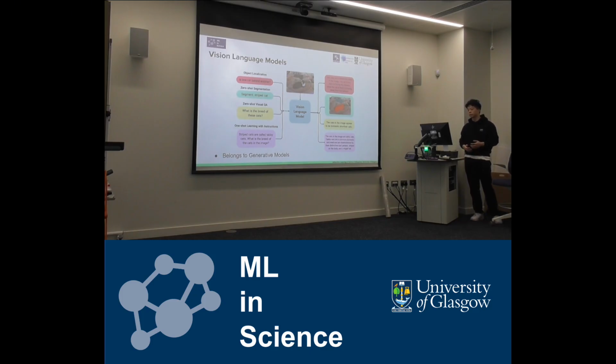In the past, these kinds of tasks often required retrieval-based methods, classification neural networks, or rule-based solutions, building a whole system. But now you can use a single visual language model. We can handle all of these tasks, and more flexibly, in a unified framework.